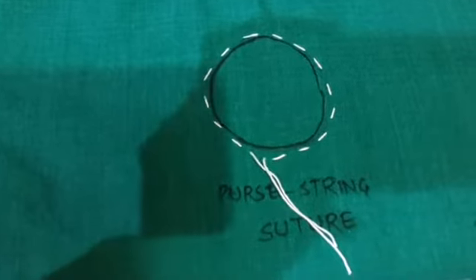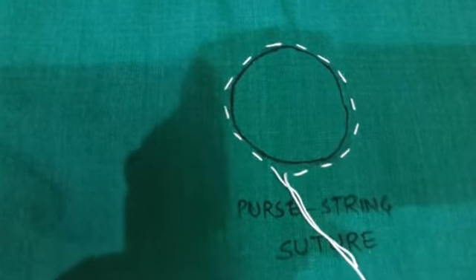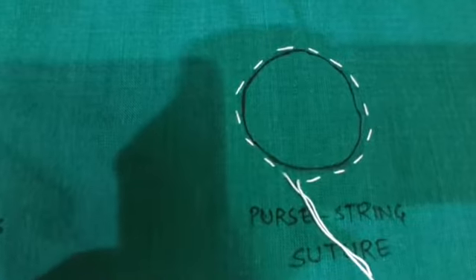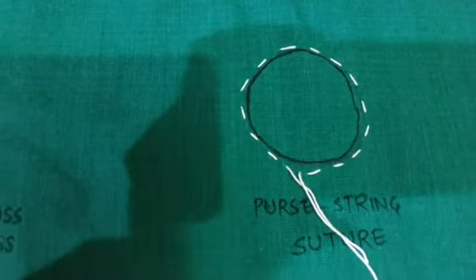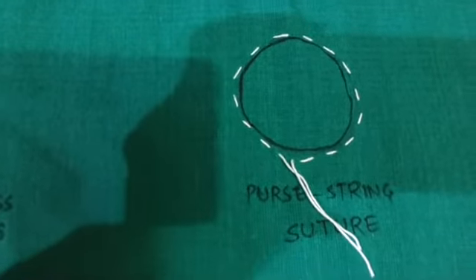This is the purse string suture and it is used to narrow the lumen of hollow organ, and also to constrict the anal opening after the rectal prolapse.